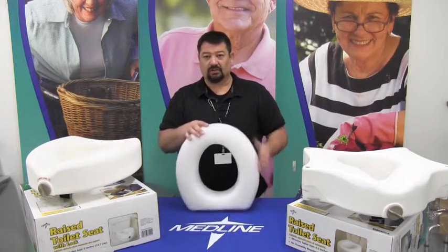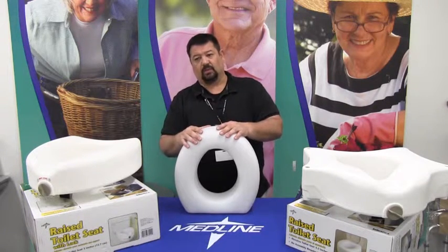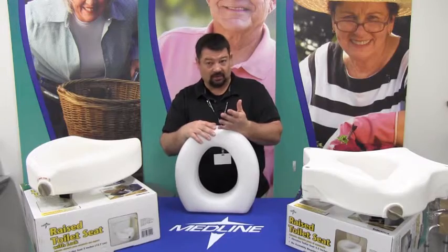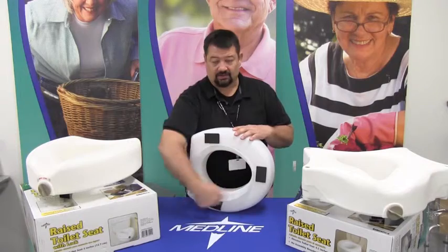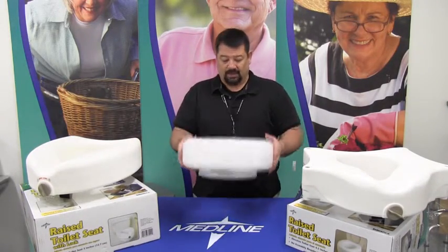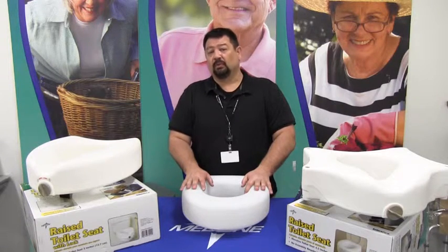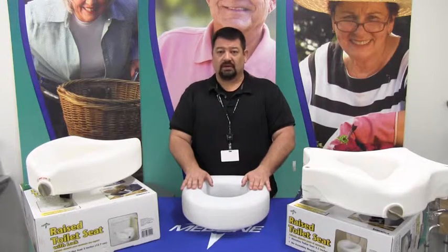The first one we're going to cover is the non-locking. The idea of a raised toilet seat is to increase the height of the platform that you sit down on, for people who have had hip issues, knee issues, or simply raising and lowering issues. This particular version has a splash guard on the inside to help keep things more sanitary, and it simply sets down onto the porcelain portion of the commode. Depending on the type of commode, you may or may not have to remove the seat and lid, but as a rule this version does not require having to take off the seat and lid.